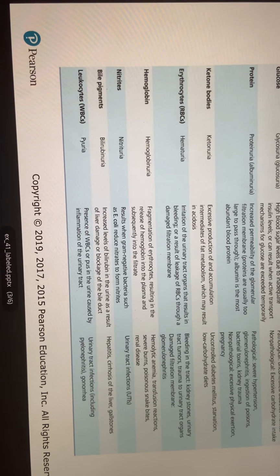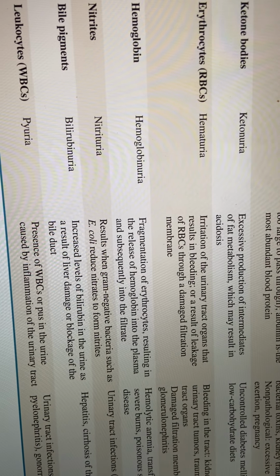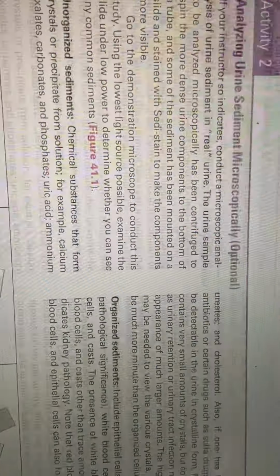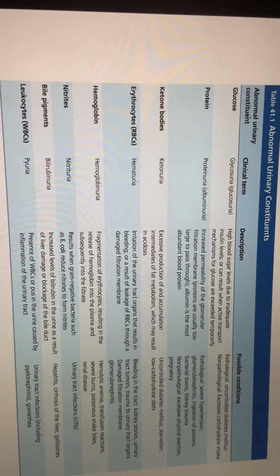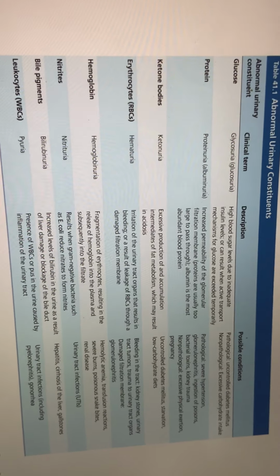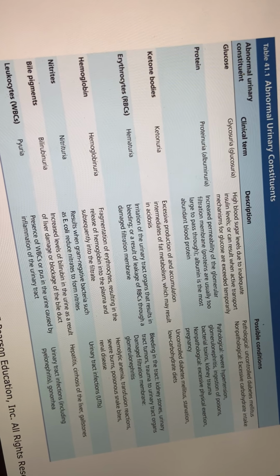Pale, medium, dark. Yes. If it's a standard urine sample, it should be physiologic urine, okay? When I say physiologic urine, it should be within these normal values. You get that? When we always say physiologic, it's normal. When we say pathologic, it's abnormal, okay? So color, pale yellow, you can say pale, medium, darker yellow, because these are variants, okay?